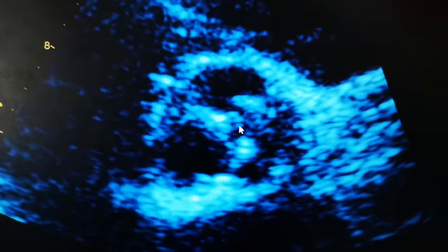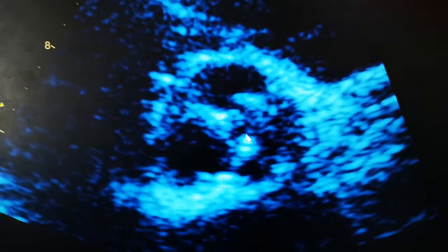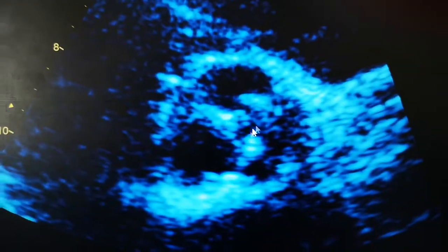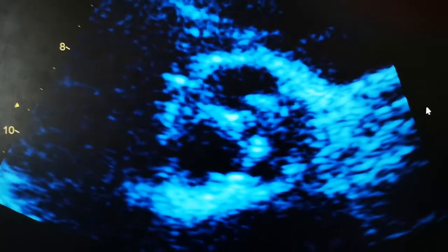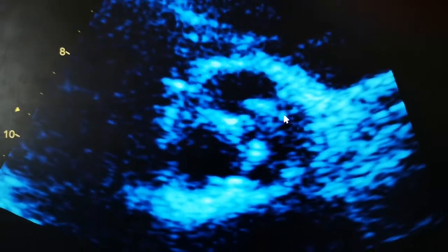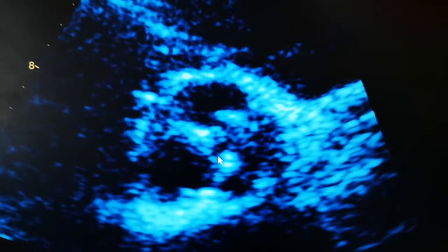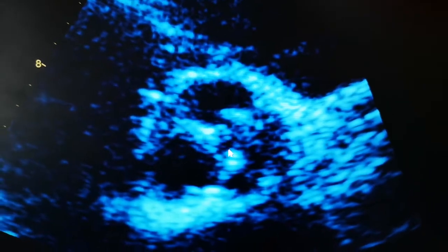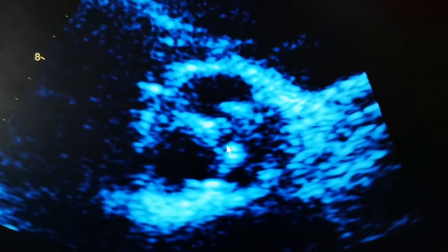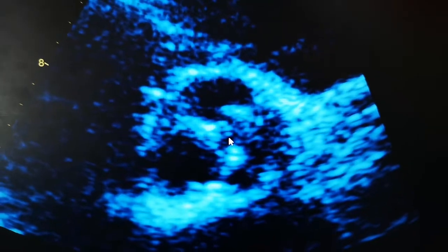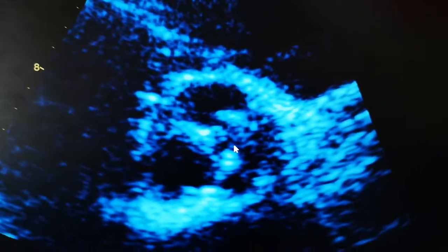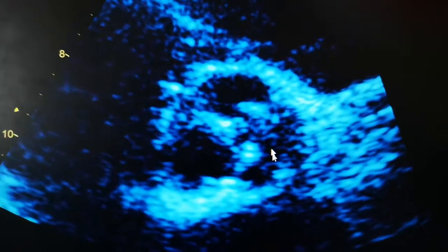You can see this little gap in the middle that clearly says the approximation or closure of the commissures is not good enough — there is a hole. If you put some color Doppler, you would expect some aortic regurgitation.